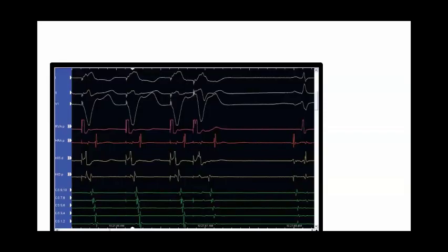And this is very important to detect, because the intention of ventricular pacing is to detect possible pathways of conduction. Another thing that's very important during ventricular pacing, and will be important also during atrial pacing, is that with pacing, tachycardia may be induced. And this is one of the purposes of pacing, to induce tachycardia. And by induction of tachycardia, you study it, determine its etiology, and then determine the possible ablation target to terminate and cure this tachycardia.